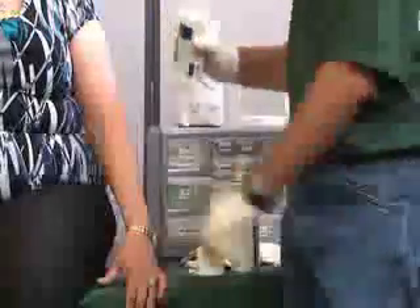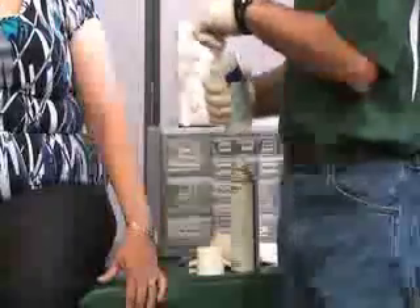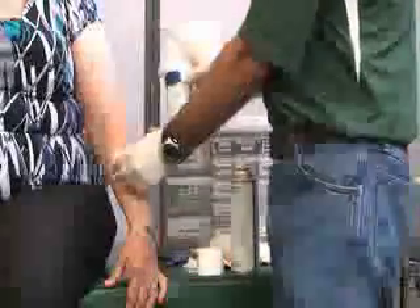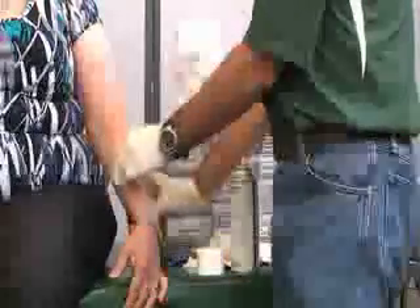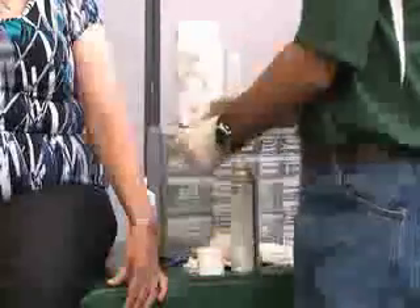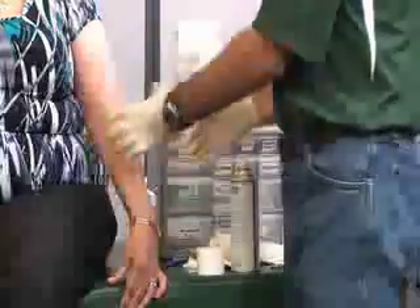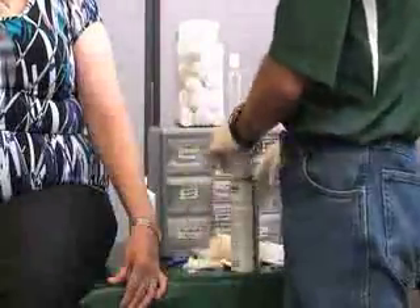To clean the wound, we want to make sure that we have saline and not any other product. We would clean the wound with the gauze ready, making sure we have our gloves on and collect all bloody parts. At that time, we would apply the adhesive on the edges with our two methods.